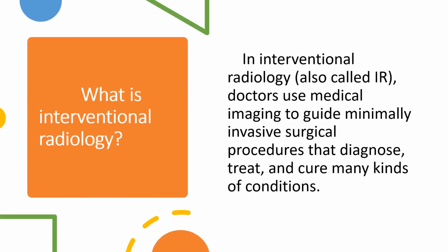So what is interventional radiology? Here it's nothing but medical imaging to guide a minimally invasive surgical procedure that diagnoses, treats and cures many kinds of conditions.